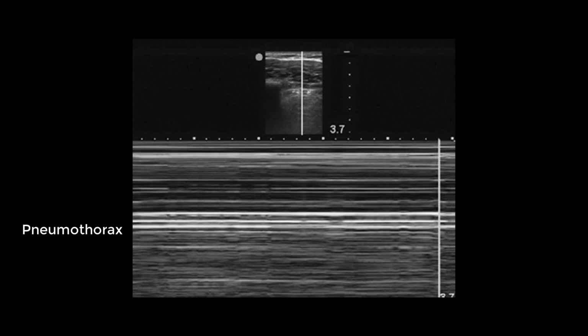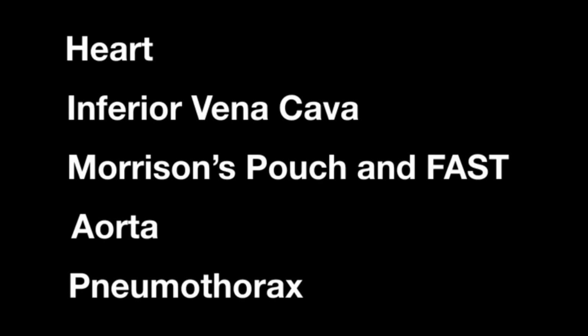So there we have our HIMAP mnemonic to give us a protocoled approach to using ultrasound in the rapid assessment of our medical hypotensive and shock patients.